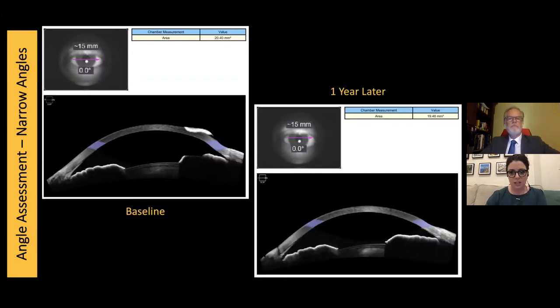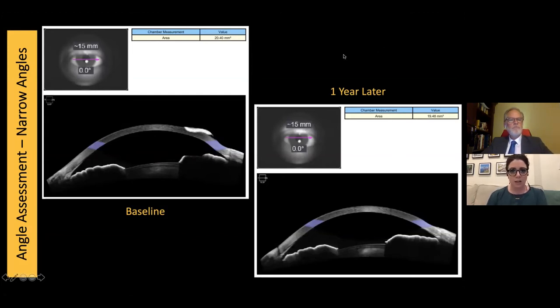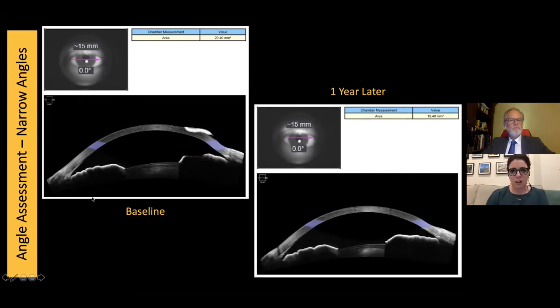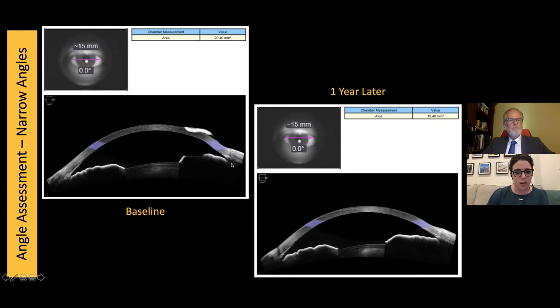Our first case is evaluating narrow angles. Gonioscopy is obviously the gold standard — something we must do — but we also have OCT in our toolbox. In this patient case, I work closely with an ophthalmologist who does LPIs. I love this angle-to-angle image where we can see the entire anterior chamber at once. It allows you to visualize the angle and the depth or area of the anterior chamber. We monitor with OCT and can track changes — this patient had a one millimeter squared change in area over one year.